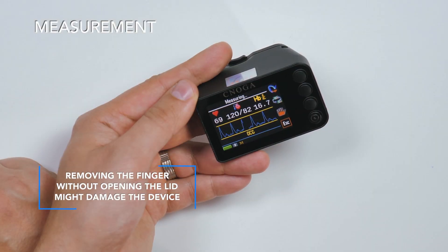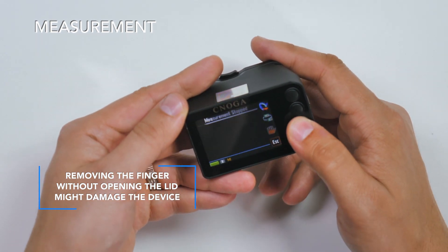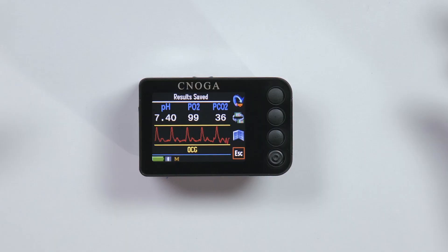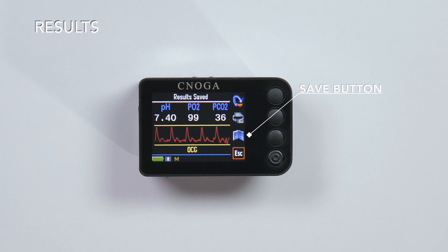To end the measurement, press on the hand icon or open the lid and withdraw your finger. To save the measurement, press the save button. To return to the main menu, press the back button.